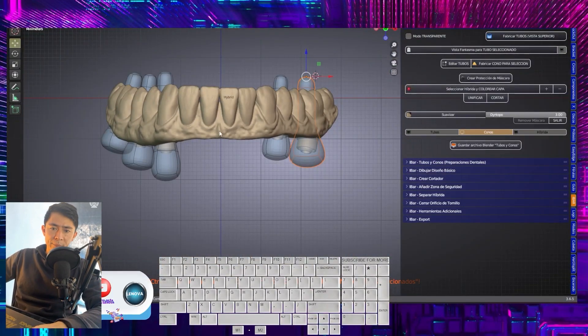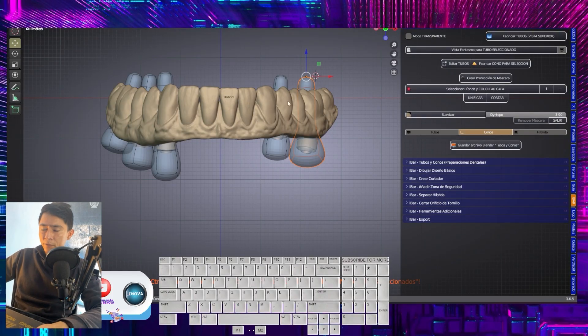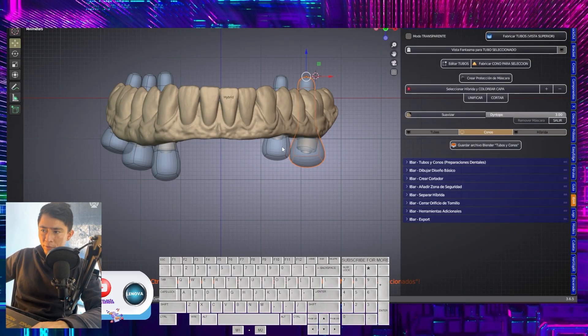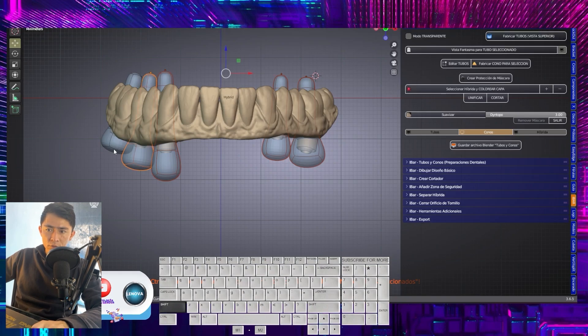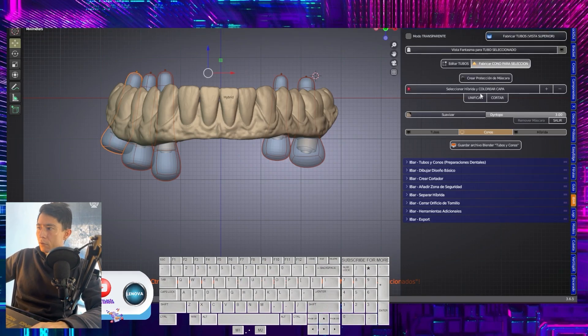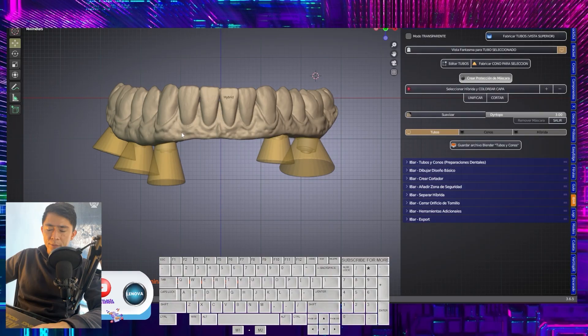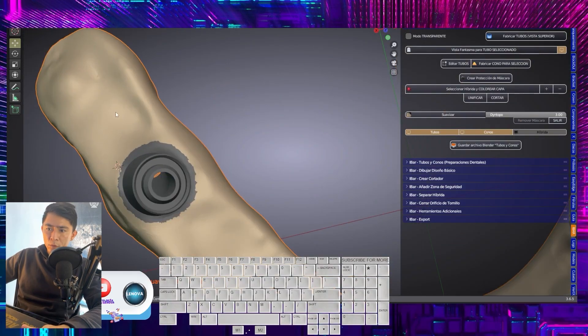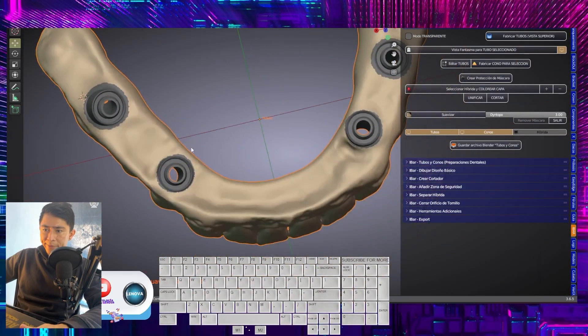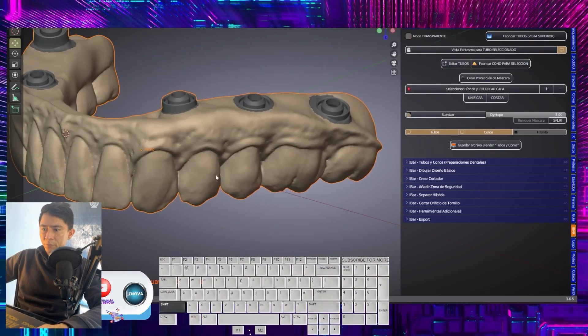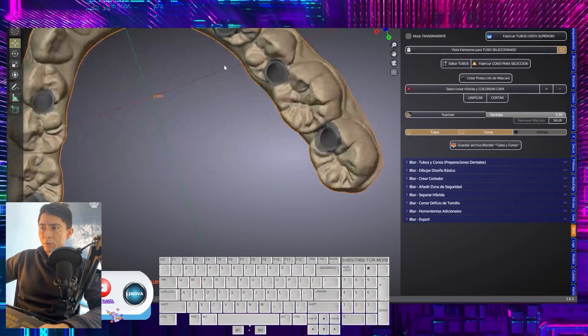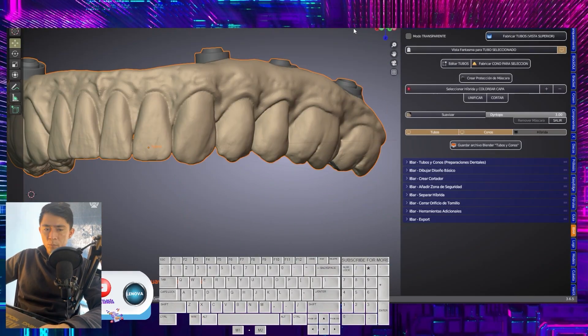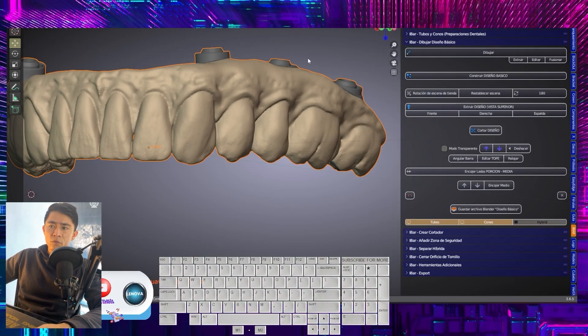Once I finish modifying or editing each of these cylinders, what I will do is create the cones. I am going to select the five cylinders. I indicate make cone. And now protective mask. We check that only the interior of our path is protected and areas at the vestibular or lingual level are not exposed. We move on to the second section.